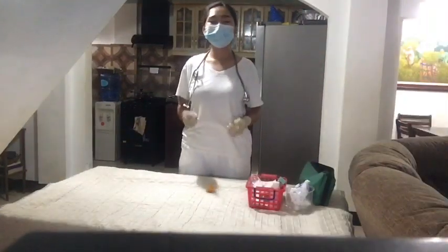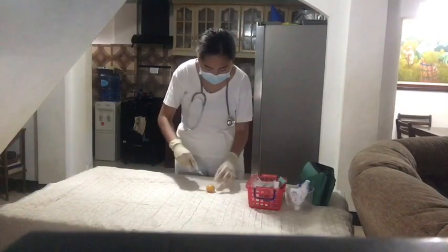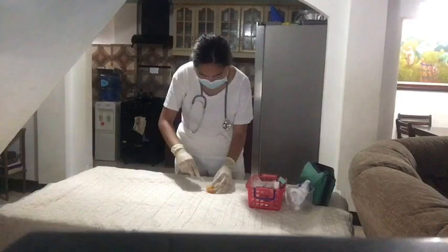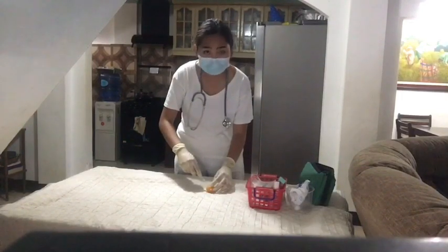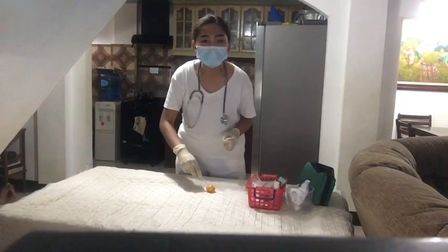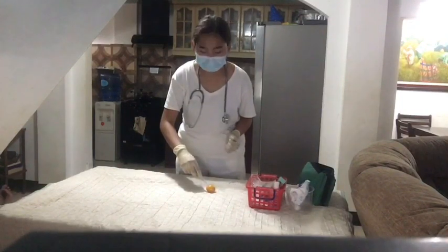And now we will inject the skin with bevel up at 45 to 90 degrees. And release the skin to avoid injecting into compressed tissue.